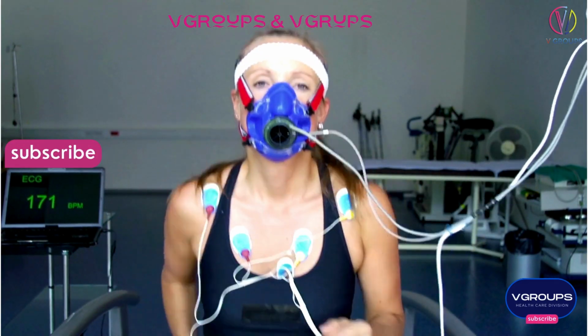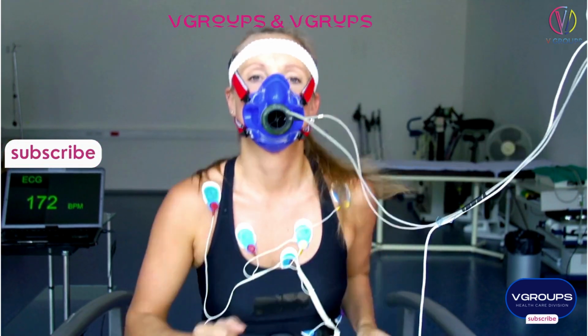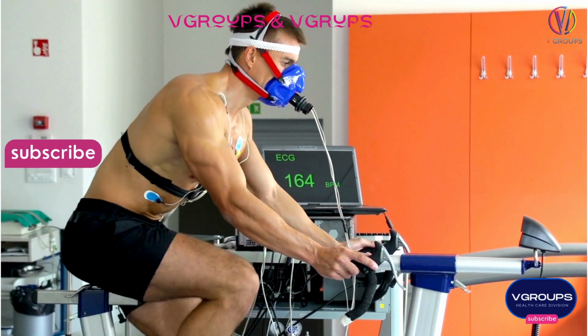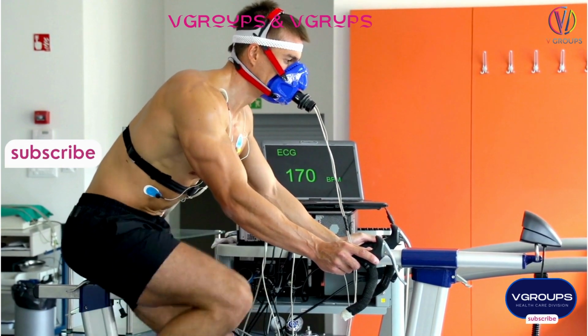Exposure levels. ECG is a non-invasive and safe procedure with minimal exposure to electrical impulses. The electrodes on the skin pick up the body's natural electrical signals, and the equipment used in modern ECGs is designed to ensure patient safety.